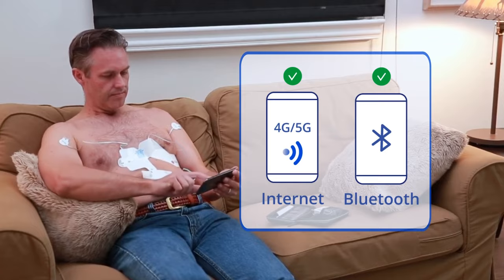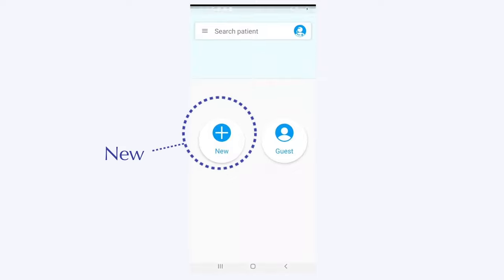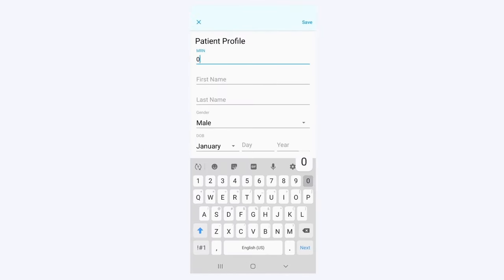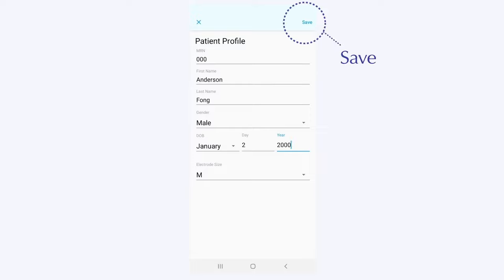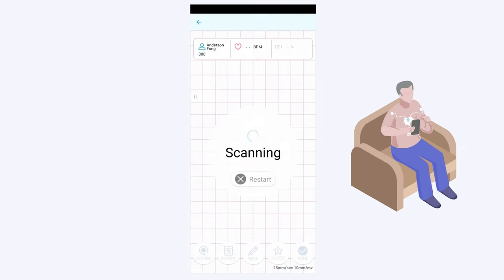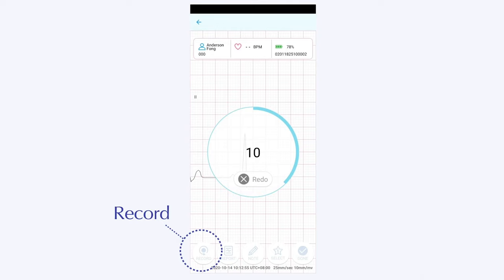Launch the app. Log in with the username and password you've received. Tap the New button and enter your information. Tap Save. Sit back and relax your muscles. The app will automatically connect to the recorder and record an ECG. Please press the Record button and record two more ECGs.